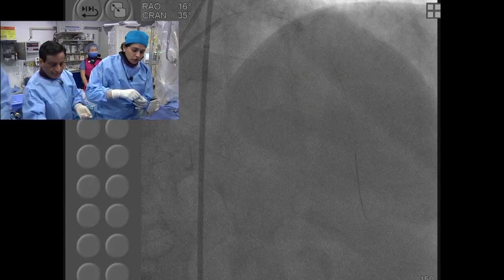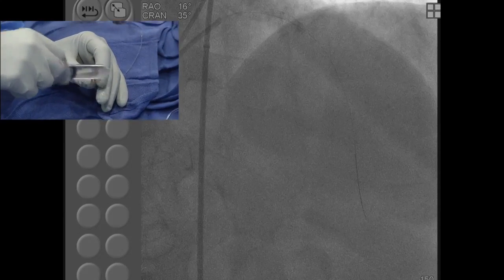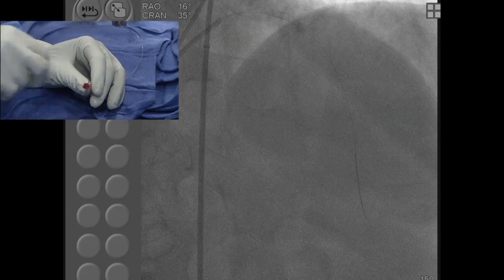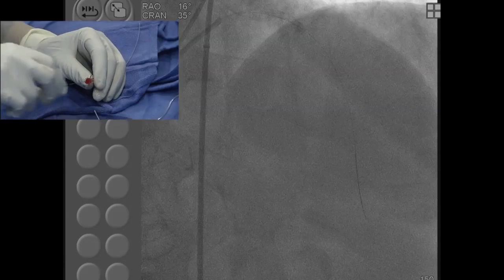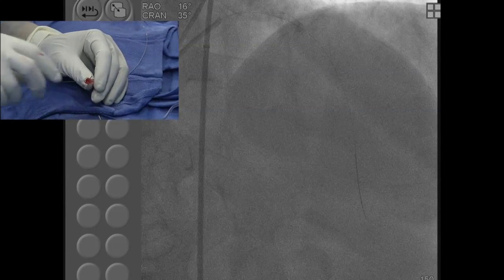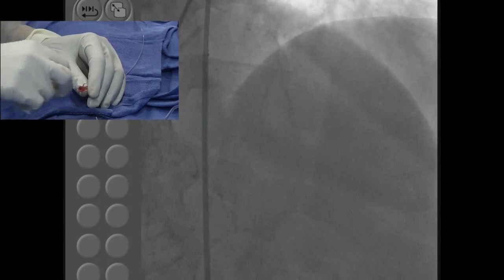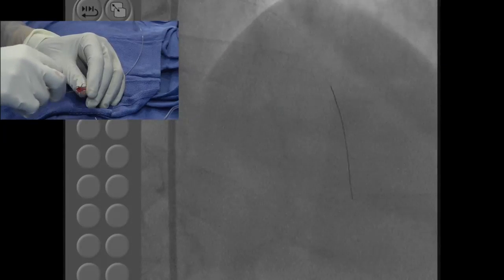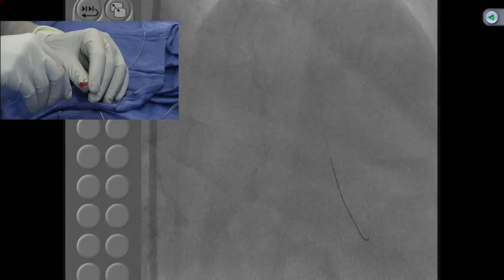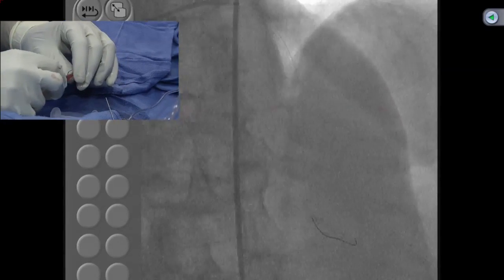This is one misnomer we have in the CTO literature: nobody uses Angiomax, but they all want to use heparin, thinking that you can give protamine if you have any perforation. But ever since we started using Angiomax four years ago at Mount Sinai, every CTO has been done with Angiomax, and no issue even if you had a wire perforation. I can show you the little cloud that we saw with the Angiomax, and right now you don't see that cloud anymore.